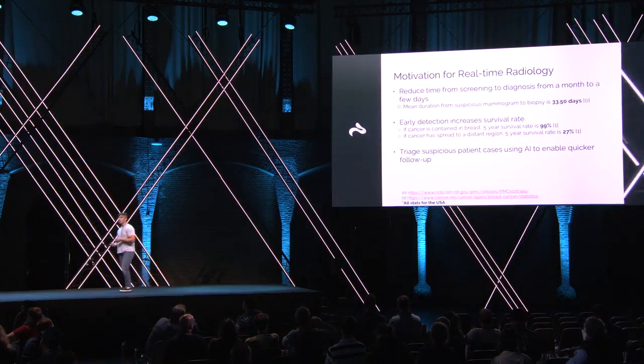So now we have some of the problem context in our mind. Now let's talk about the underlying motivations. One of the key ones is we want to reduce the time it takes from the screening to the diagnostic stage for a patient. Typically this is 30 days. When you are going to be checked for breast cancer, typically you will go for either an annual or biannual mammogram. And this starts off as a screening phase, which is an initial test. It's one of the less invasive images they can generate.